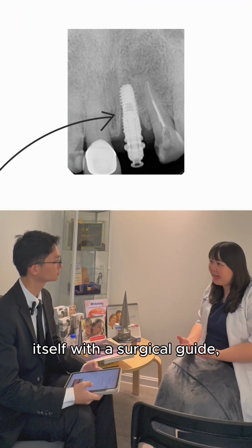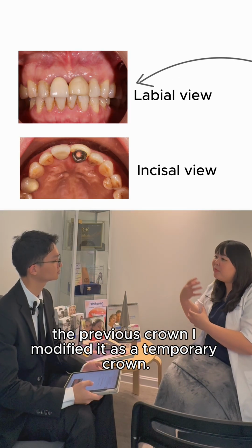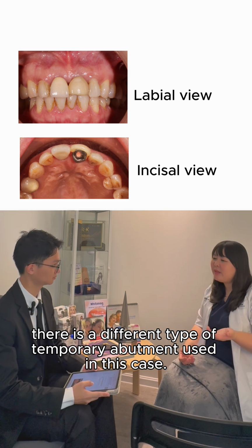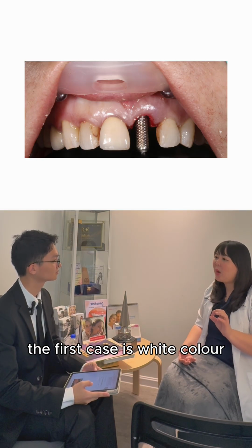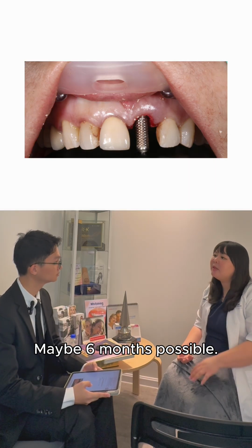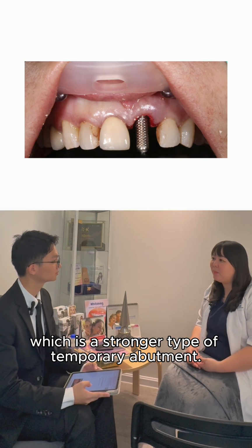itself with a surgical guide, and then immediately I used the patient's own crown. The previous crown, I modified it as a temporary crown. Okay, so you can also see there is a different type of temporary abutment used in this case. The first case was white in color, and this one is metal because I wanted it to last longer, maybe 6 months if possible. So that's why I used metal, which is a stronger type of temporary abutment.